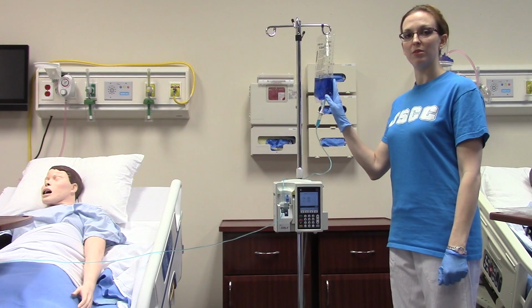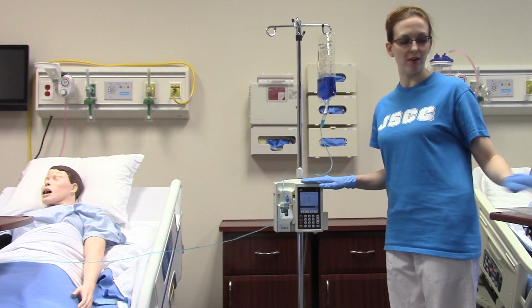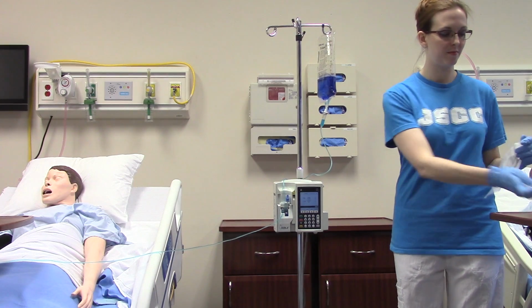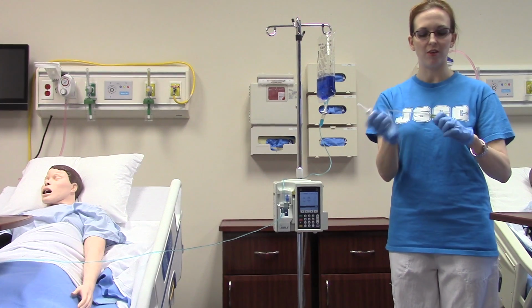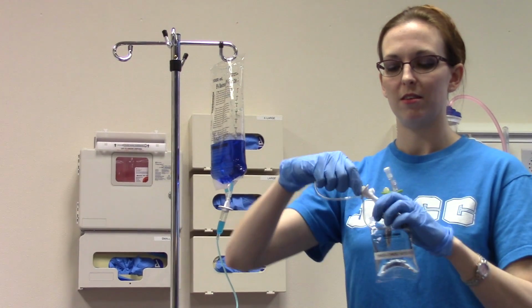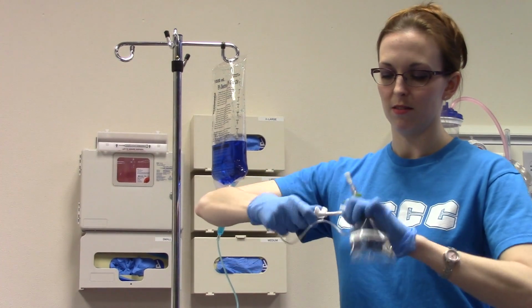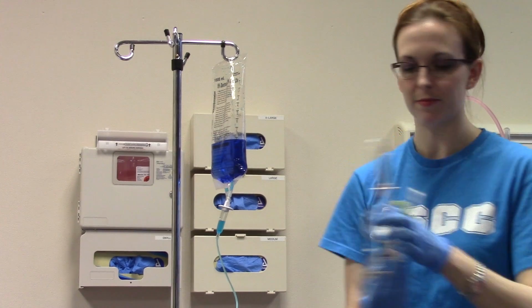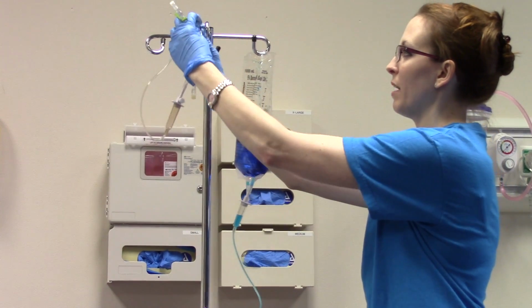Now we have our fluids connected to our patient and our pump is running. We're now ready to hang our antibiotic. So I'm going to get the secondary set. Make sure I clamp the tubing, not touching the spike. Spike my piggyback bag. Now I'm going to hang up my piggyback.